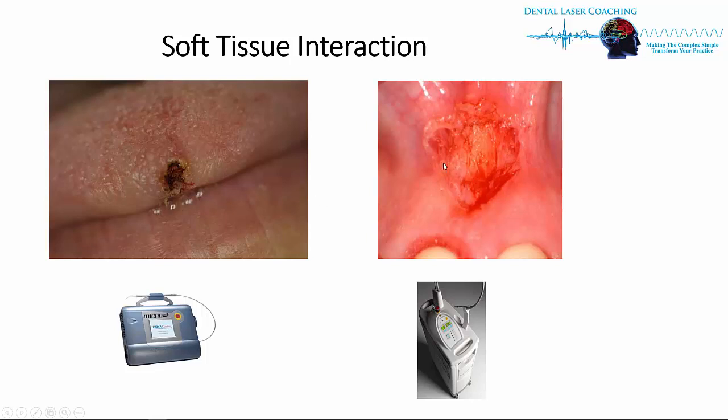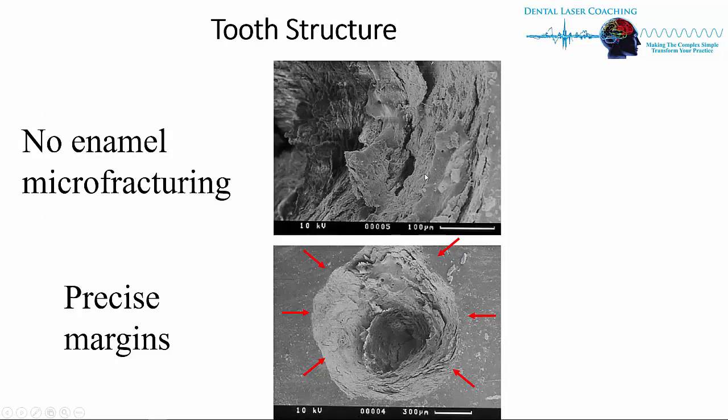As opposed to, you can see here, this is a soft tissue procedure done with an erbium, and it doesn't interact with the melanin hemoglobin. There is no char. You can see there's a little bit of oozing, but look at the vascularity and the little fibrotic tissue right there. There is hardly any trauma or edema. That patient will heal great.